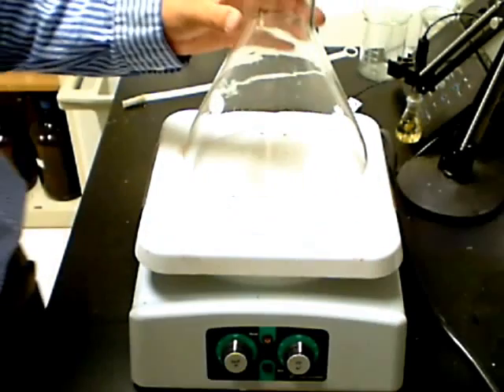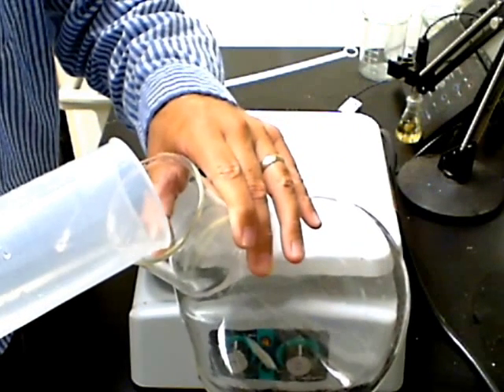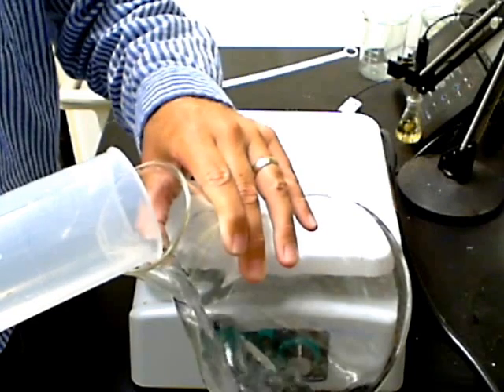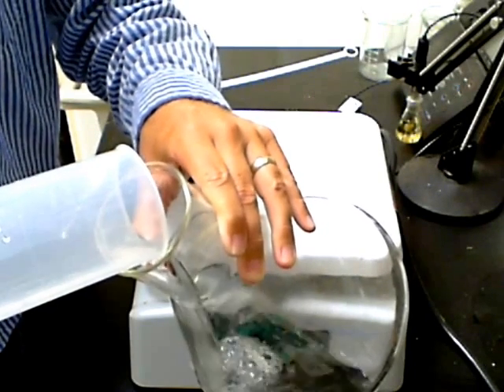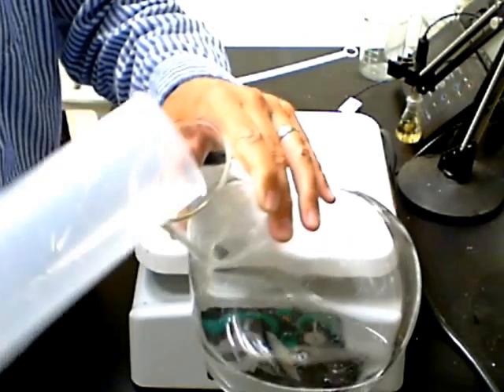The flask should be three to four times the volume of the total solution we will be mixing. In this case, we will be making 500 milliliters of the solution, so the flask should be two to three liters in total volume. Carefully decant the 500 milliliters of water from the graduated cylinder into the flask.